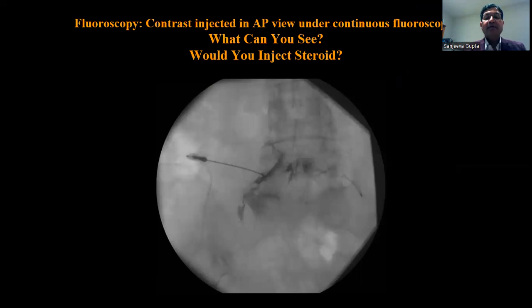Contrast injection in AP view under continuous fluoroscopy. What can you see? As I've already said, you can see a vascular spread. Would you inject steroids? I've already said that non-particulate steroid may be injected after withdrawing the needle or going a bit deeper and confirming that the vascular spread has disappeared. But I would certainly not inject a particulate steroid once I've observed a vascular spread. Or look at alternative ways. Interlaminar epidural, a caudal epidural could be considered.